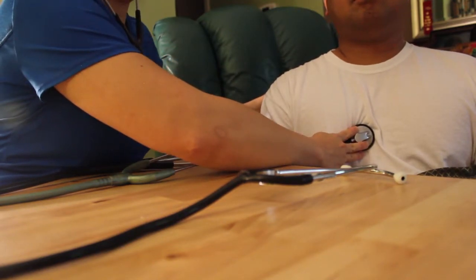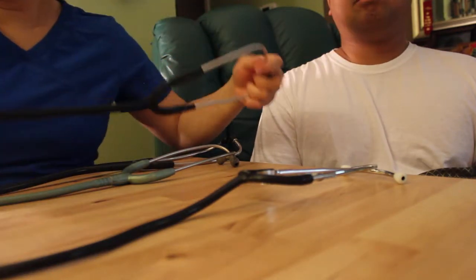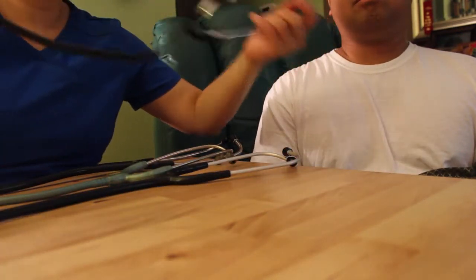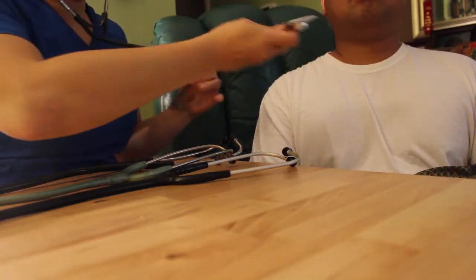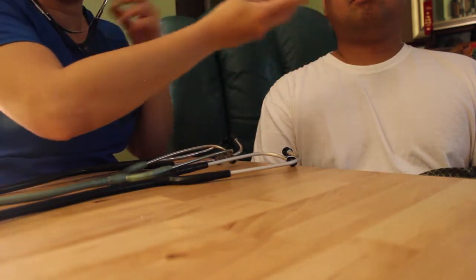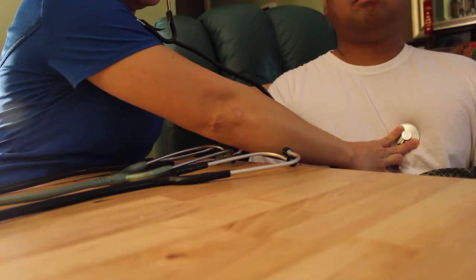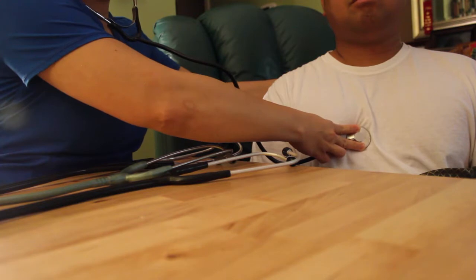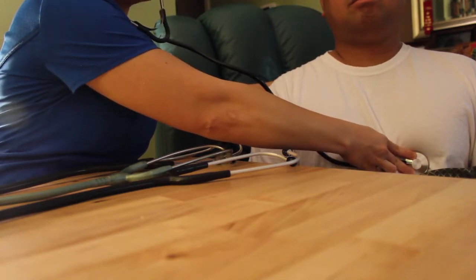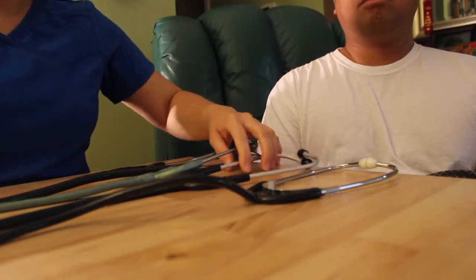Next is the Rely On stethoscope. The sound is not that loud compared to the other two — I can barely hear the heart sounds. Last is the non-branded stethoscope. Before I even started, just touching the tubing or putting my hand on the chest piece, it's already picking up a lot of noise. The sound is really soft — I can barely hear it using this kind of stethoscope.